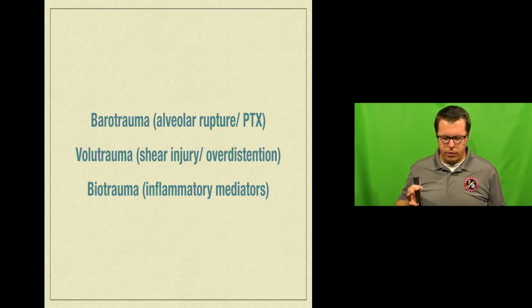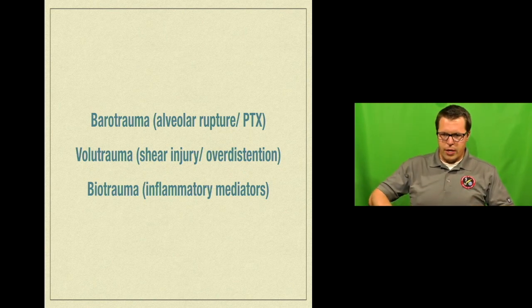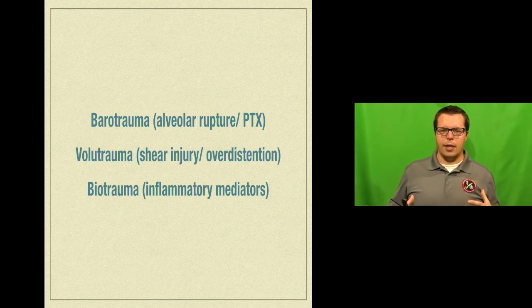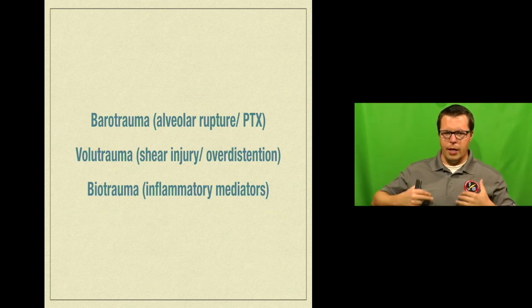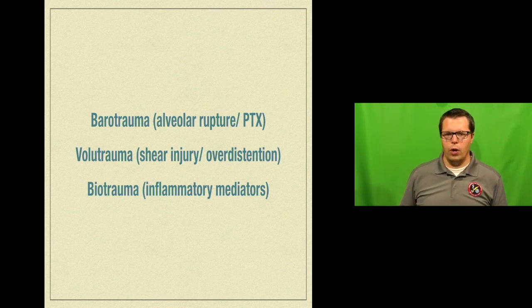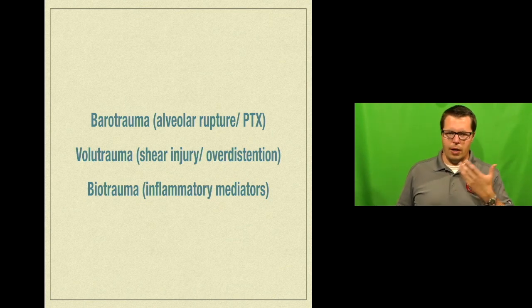If you think about the way that we breathe typically, we breathe through negative pressure ventilation. We have a diaphragm, the diaphragm goes down, the space in our chest increases. That means there's negative pressure inside the chest, and so air is drawn in through our trachea, through our airways, and down into our lungs themselves. And then when we release our diaphragm, pressure goes back to atmospheric pressure and stuff goes out of our lungs.